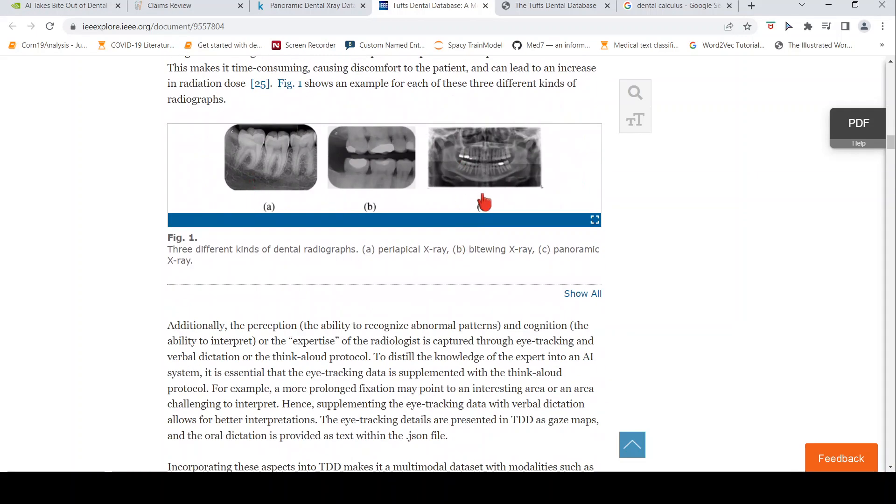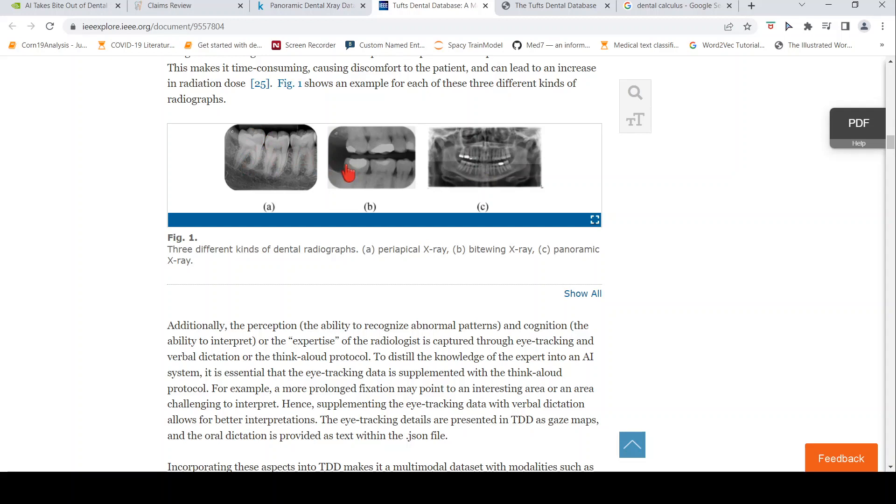Now coming to the type of X-rays, this is a panoramic X-ray. It gives a full view of your mouth along with the teeth. This kind of X-ray is called a periapical X-ray. This is a bite wing X-ray. They have annotated panoramic X-rays.